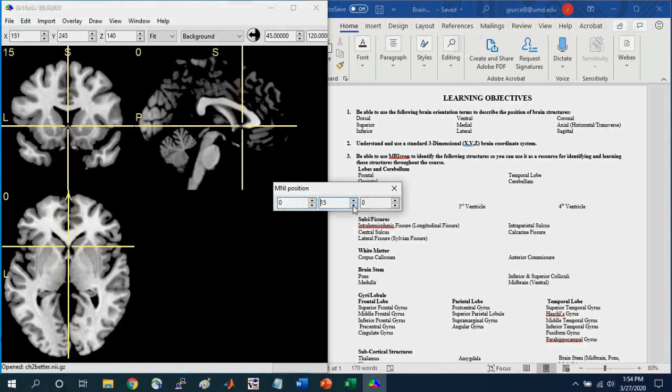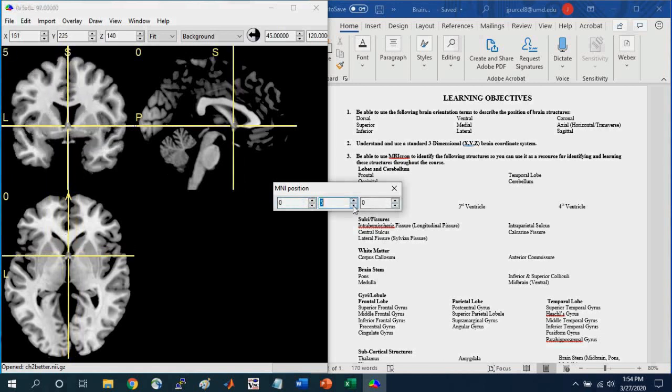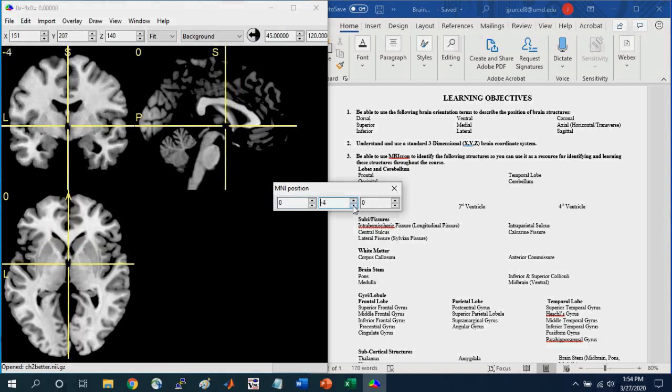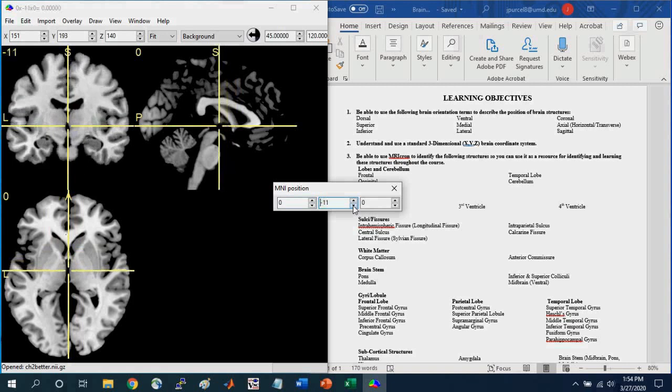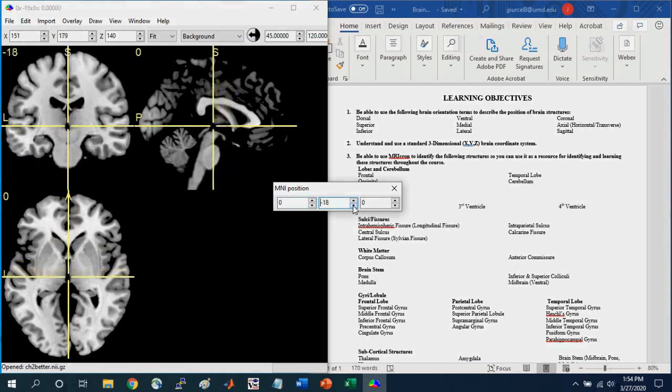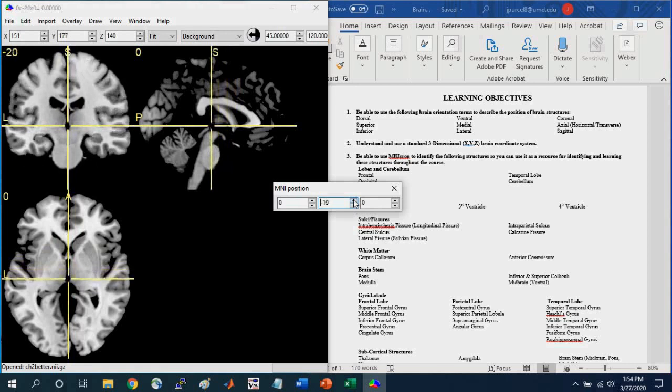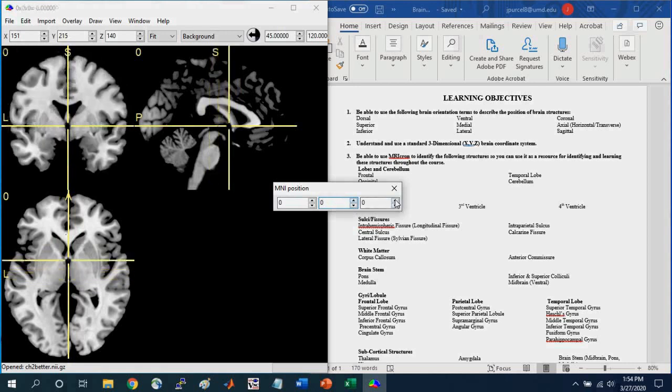And so if we increase the Y, we're going more anteriorly. And if we decrease, if we're going negative, in the negative direction, we're going more posteriorly, okay? And then the Z, if we increase the Z values, we're going more superiorly or dorsally.